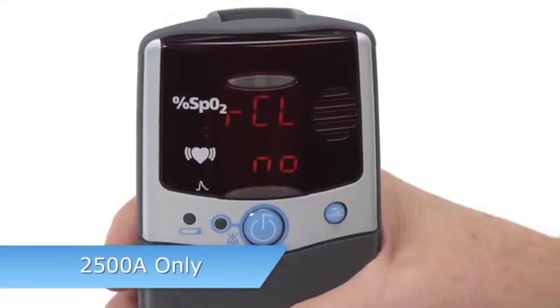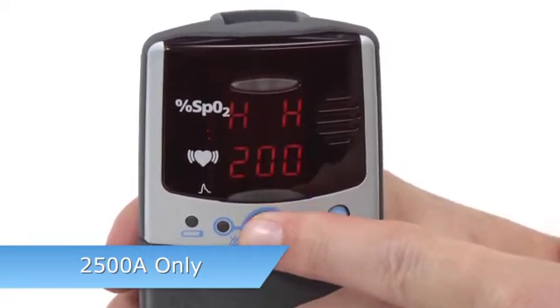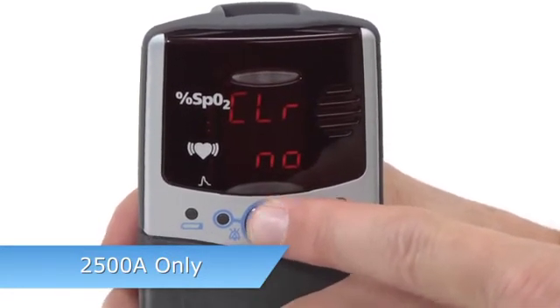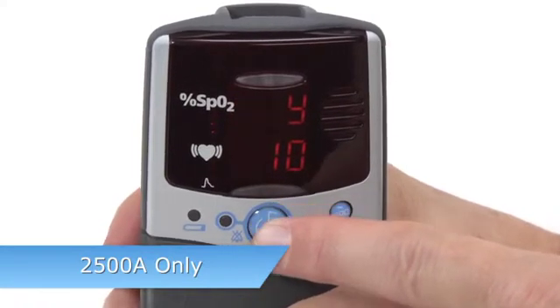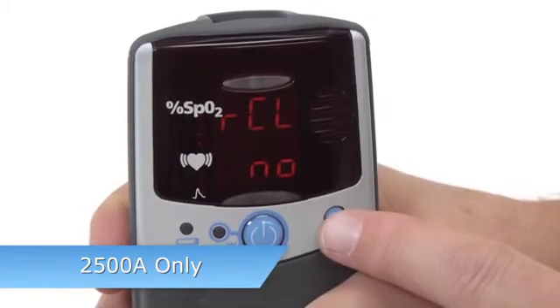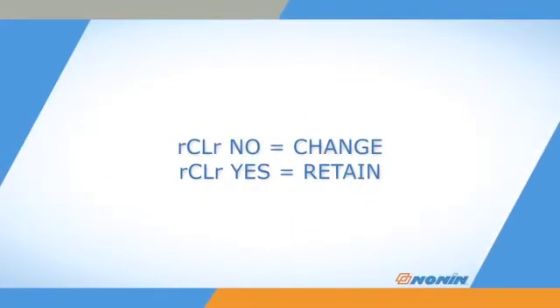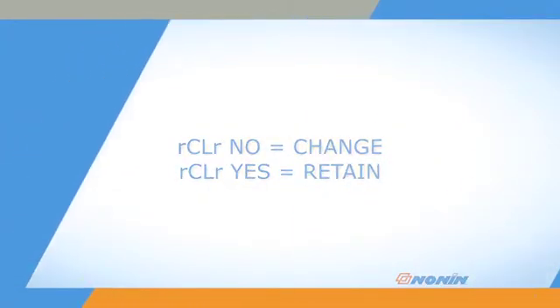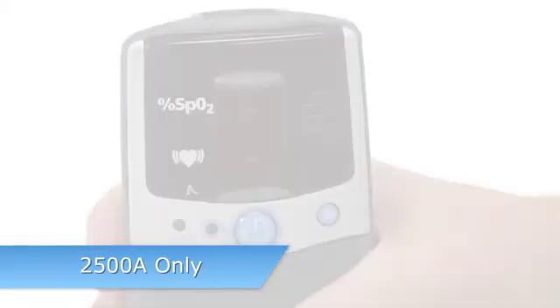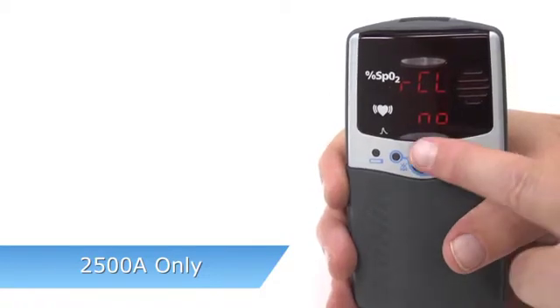For the 2500A model, when you enter Setup, the Recall alarm values NO option appears first. Memory clear, date and time settings follow after alarm settings. If you clear the custom alarm setting, the oximeter will return to its default settings. Press ON-OFF to clear the custom alarm settings, or use ADVANCE to select YES to retain the custom settings. If you retain the settings, you will automatically exit Setup Mode.